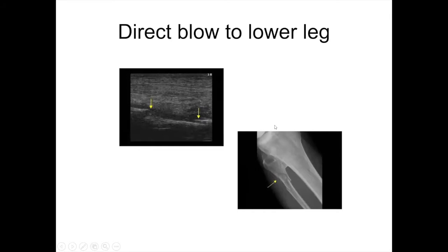This is a direct blow to the lower leg — the fibula. You can see the cortex here, a depression of the cortex, fluid, and then further depression. This is a comminuted fracture of the neck of the fibula. The peroneal nerve may be at risk because it winds around the neck of the fibula. You can see the comparison between the displaced comminuted fracture on ultrasound and on the x-ray.